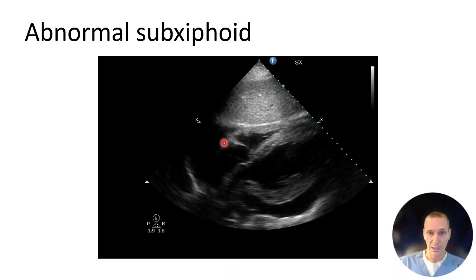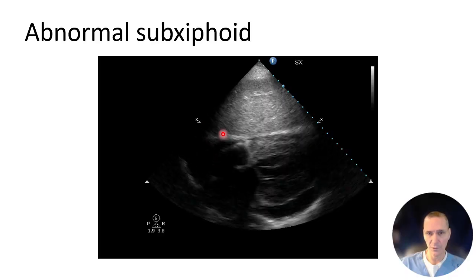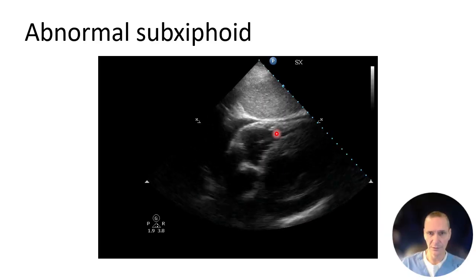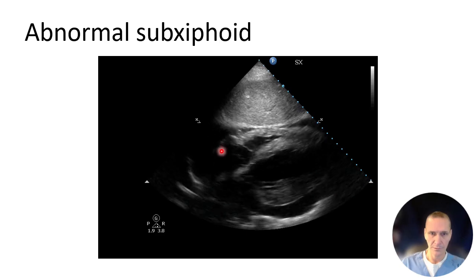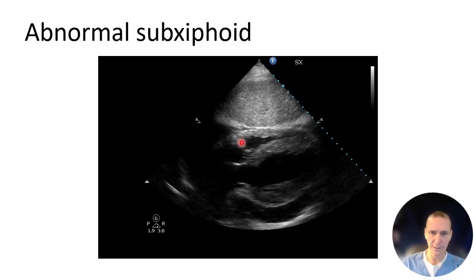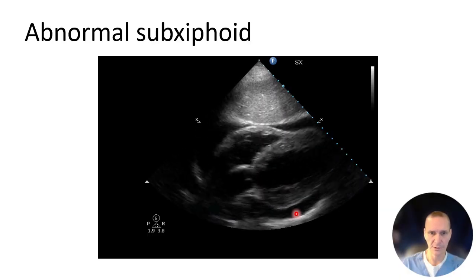Here is a pericardial hemopericardium or effusion, depending on the setting. We know there's fluid around the heart, so this is the liver up here. You have fluid all around the heart, and then look how the RV is collapsing in. And generally, actually, the first indicator will be the RA will collapse, but you're looking at the right side of the heart, and if it's starting to cave inward, it's telling you that there's hemodynamic compromise.